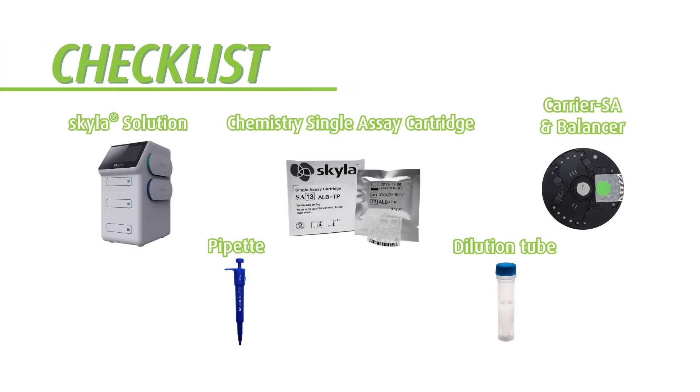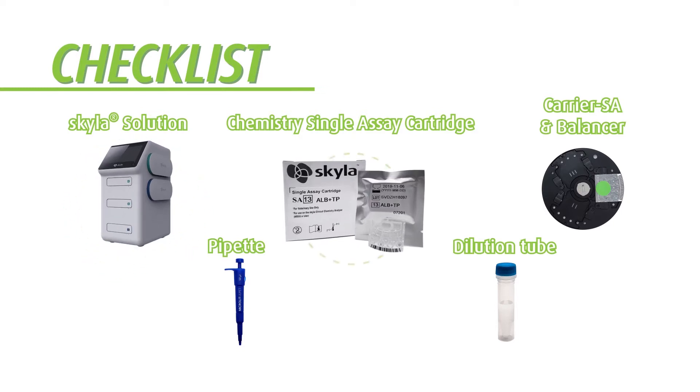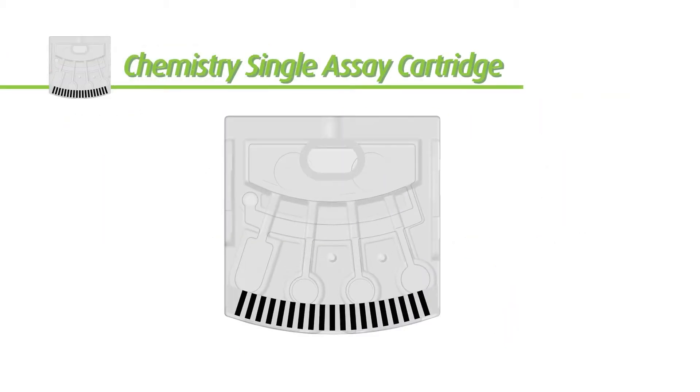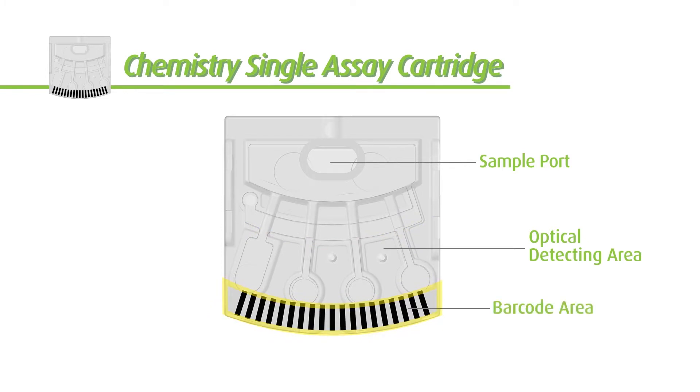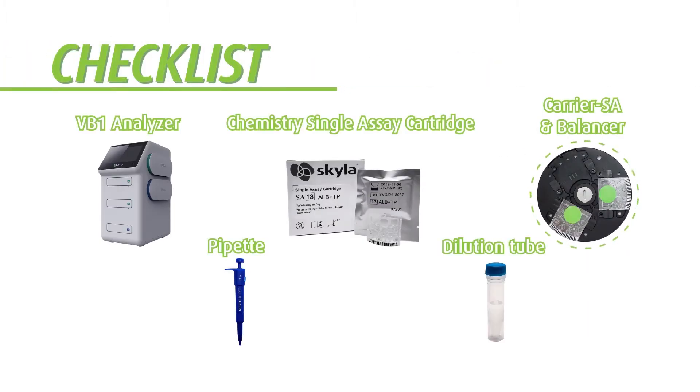Let's quickly check if all major materials are ready before the test can be performed. You will need: the skyla Solution, a chemistry single assay cartridge — the sample should be injected into the sample port, and the optical detecting area contains reaction wells and reagent beads. The barcode area contains the serial number, batch number, and valid date of the reagent disk. You will also need the analysis carrier and balancer, and a pipette and dilution tube containing 600 microliters of diluent.